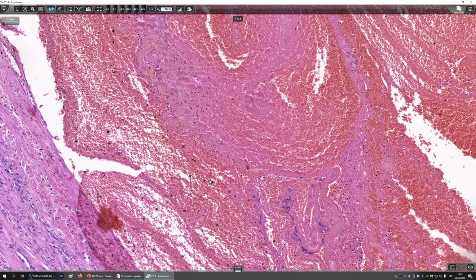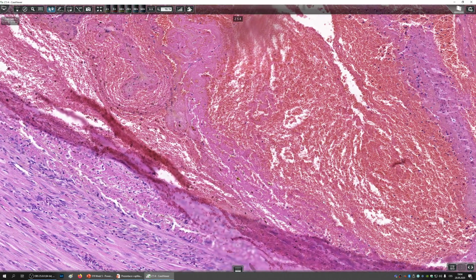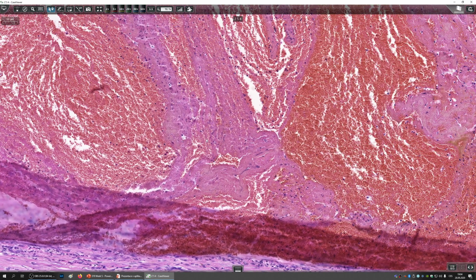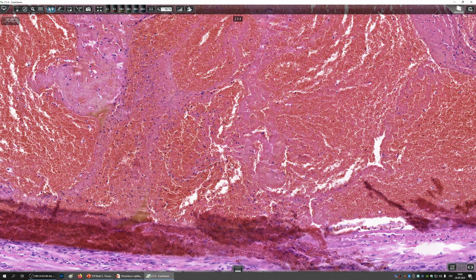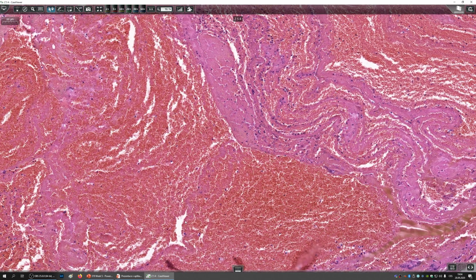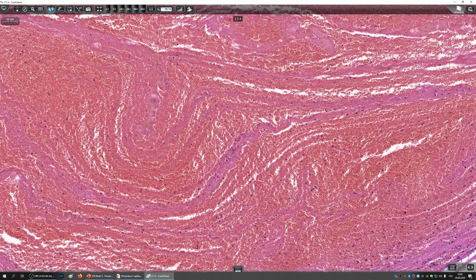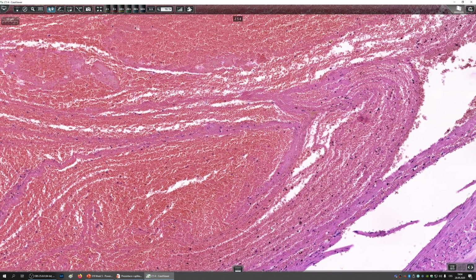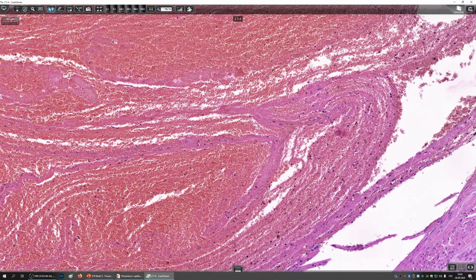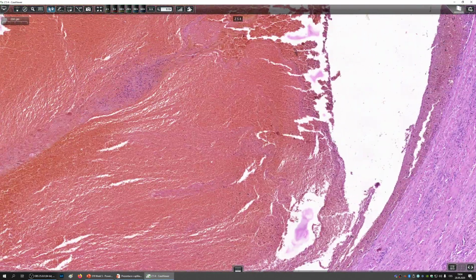You see fibrin working as a super glue, but unfortunately in this case it has managed to clog up the entire vessel. I suggest you check out the theoretical part about deep venous thrombosis. I made an audio lecture about it, so you should have a clear idea why this happens. It is one of the ways that you can kill your patient if you don't pay attention. So if you're not going to know it flawlessly with me, then you're going to have trouble during the exam. I can guarantee you that.